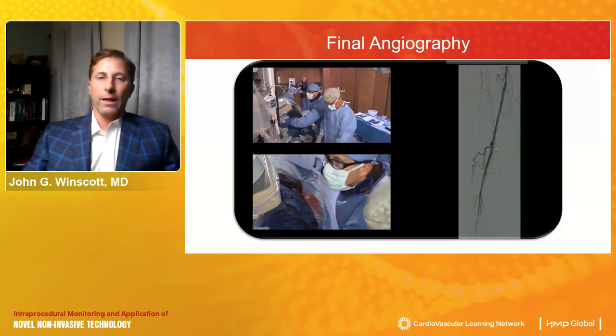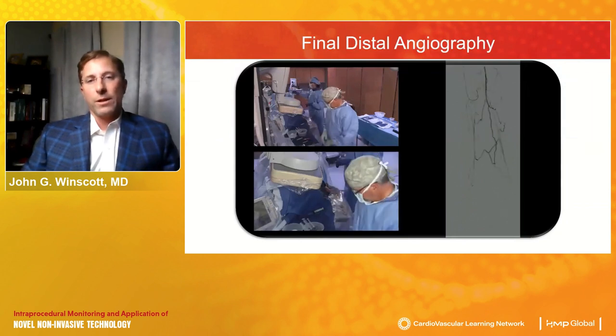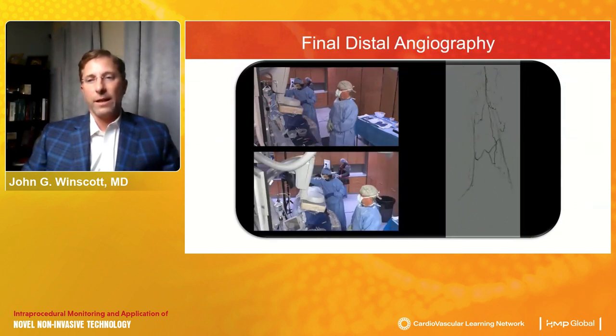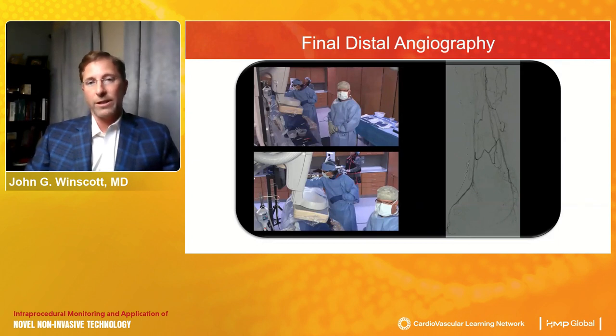And most importantly, in this patient's situation, we were able to preserve all this collateral flow to that peroneal artery, which you can see here reconstitutes very nicely. And you can see much more brisk flow into those collateral vessels that fill not only the posterior tibial artery, which was the only vessel we saw in the initial angiogram, but also now an anterior tibial artery, which has previously been hibernating, but now shows up very nicely on the completion angiography following revascularization of the popliteal segment.